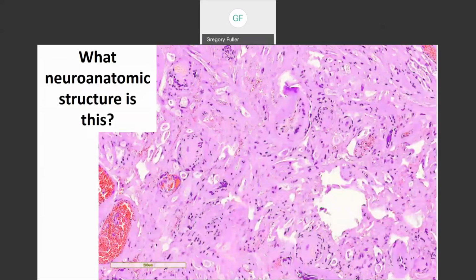Okay, I will repeat my question then. Let's go back to the surgical specimen. Now, yes, the surgical specimen included the schwannoma. I'm not going to show you a schwannoma. Why would I do that? Actually, Dr. Ginsburg brought this up. Okay, yes, Esther Bitt-Ivins. Yes, this is a dorsal root ganglion. All right, good job. Look, the key features, let's see if I can do this.